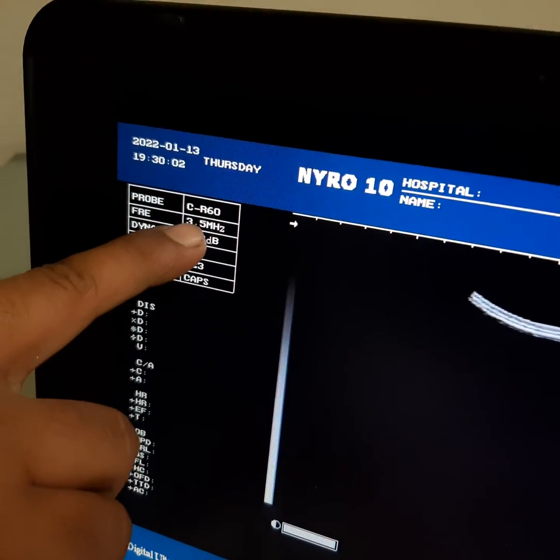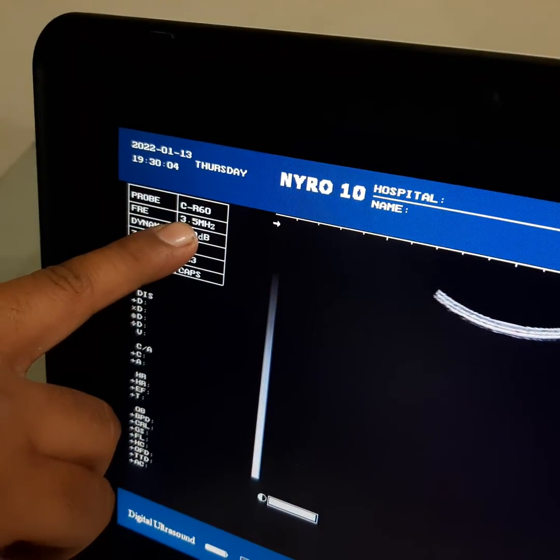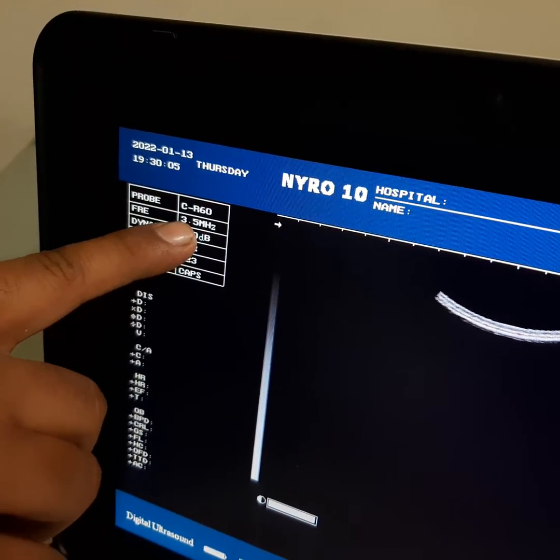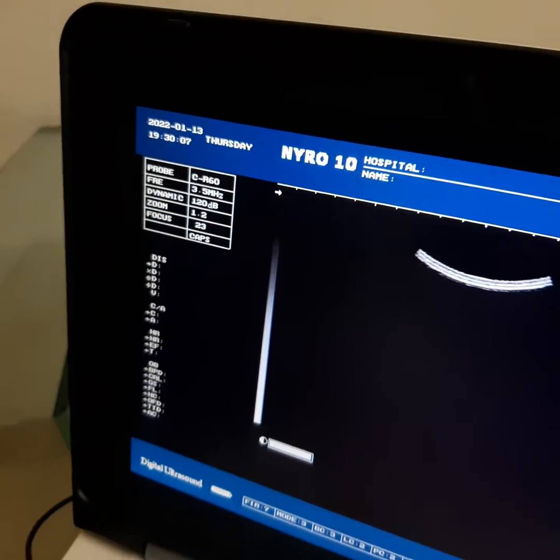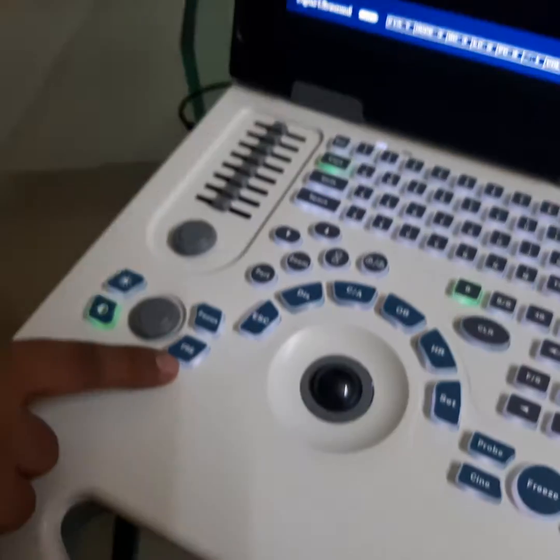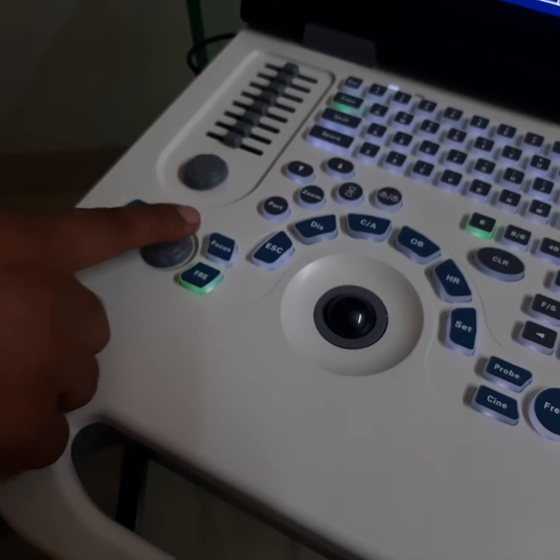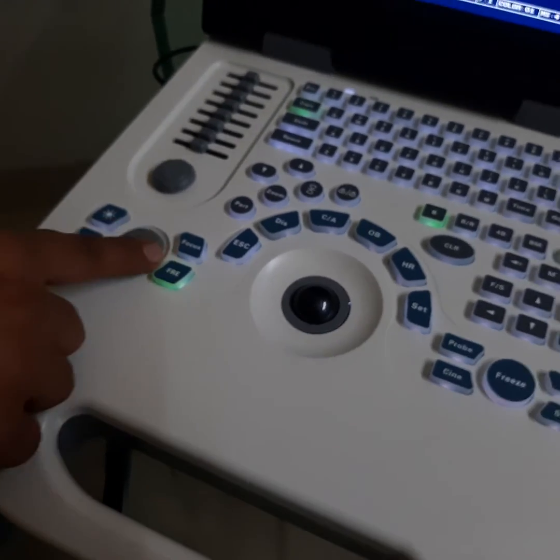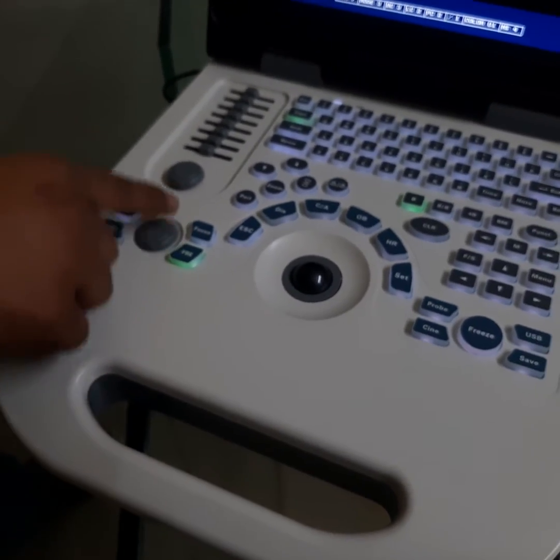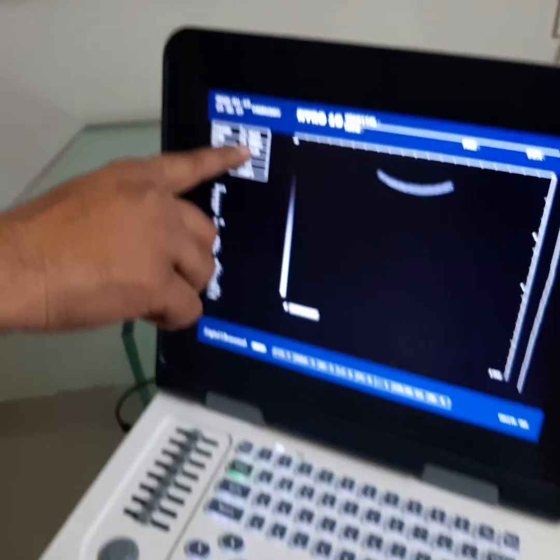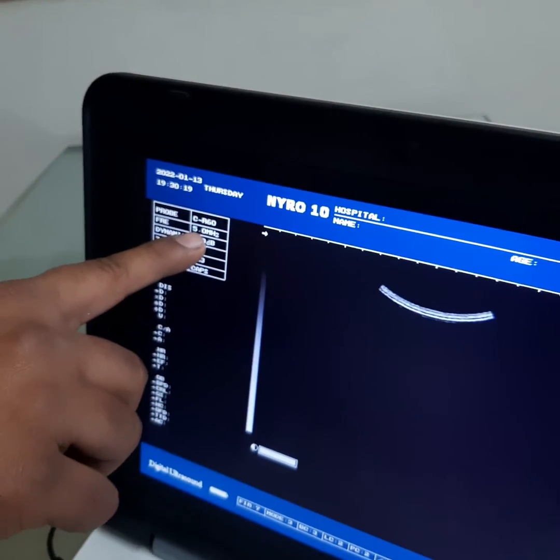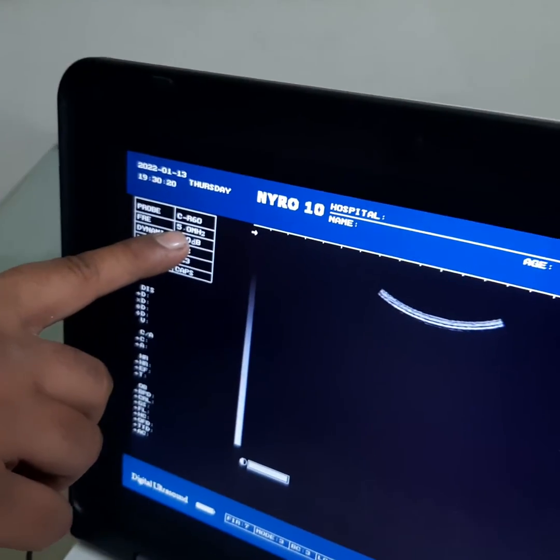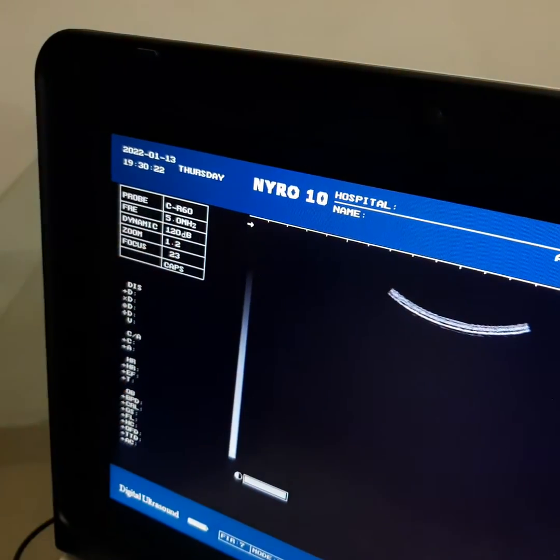Frequency 3.5 MHz. If you want to change frequency, you can press this frequency button. Press and adjust left and right to increase and decrease the value of the frequency. As you can see now, it's 5.0 MHz. Normal frequency for obstetric and abdominal is 3.5 MHz.